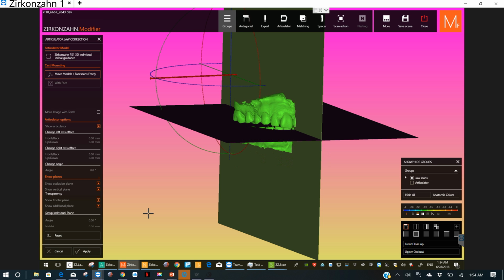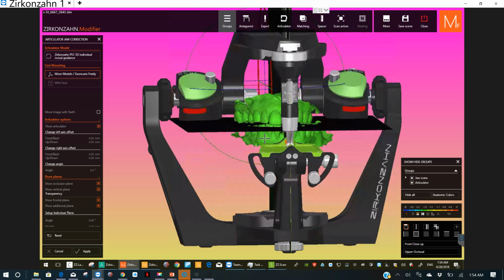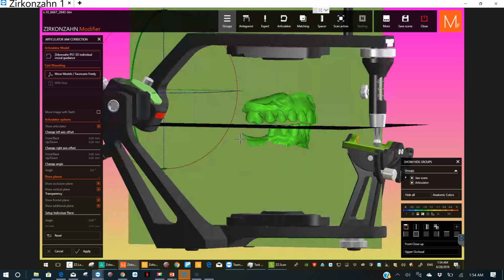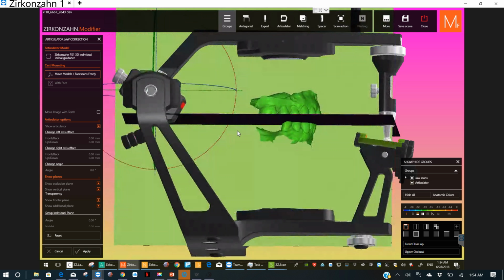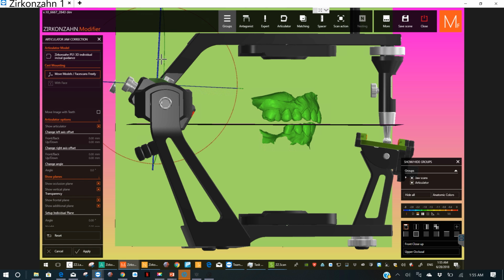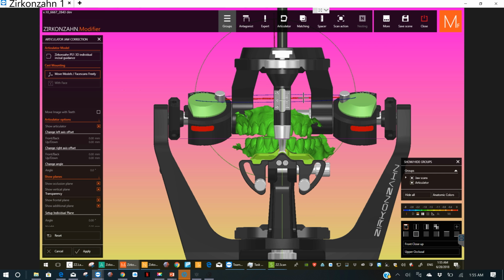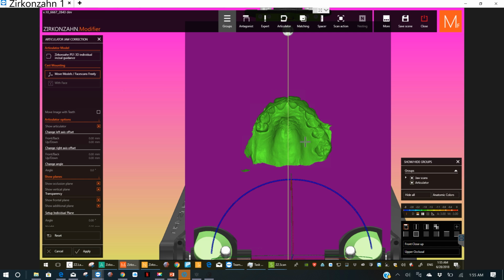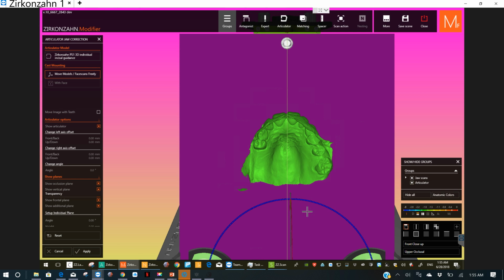I believe that horizontal one is potentially our bite plate, so we want to put wherever the desired incisal edge is. So if she wants to add 2 millimeters, then leave that 2 millimeters up. And then I like a little bit of curve so we can get our smile line. So I'm going to kind of want to split the difference back here. Okay. Every time you move it one direction, you kind of throw it off a little. I think that's looking pretty good. Maybe midlines on whole.